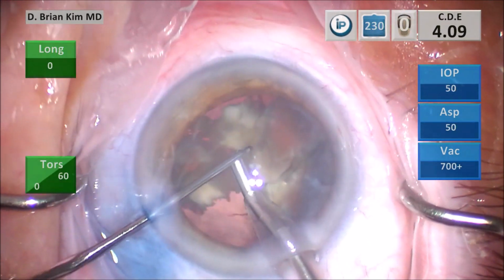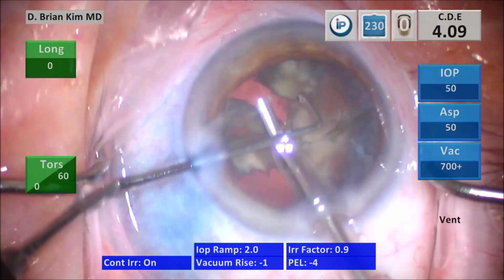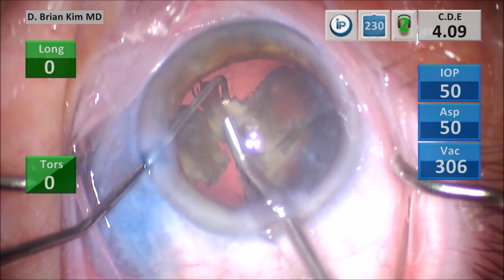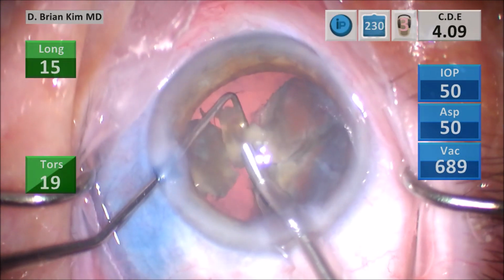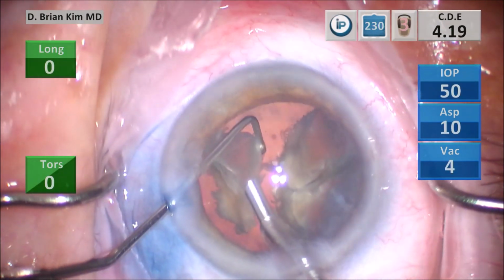You can see some of that softer material was getting in the way, so I had to remove that softer, more peripheral lens material first. And now I'm able to hook that denser endonucleus with the chopper, sandwiching it between the chopper and the phaco tip, and then emulsifying it.